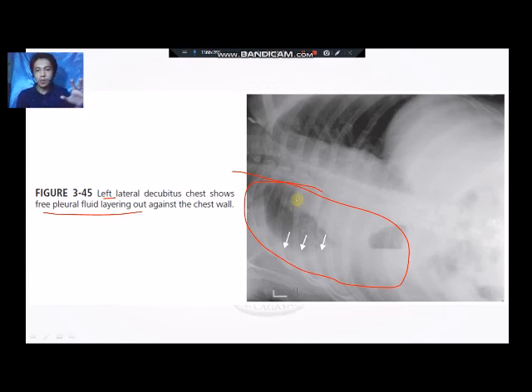Okay? So kung asa ang affected side ni patient, dapat dito pod sad nato siya ipahigda so that the fluid will go down and then the air will go up. Okay? So just imagine kung atong balihon. Butang nato ang right side ni patient is naay problema. And then pa left lateral nato siya. So the result will be ang fluid is naa diri. And then the air is naa didto. Okay, in which dili siya ma-evaluate og tarong.